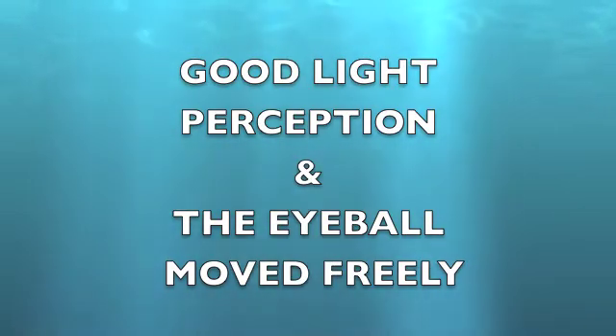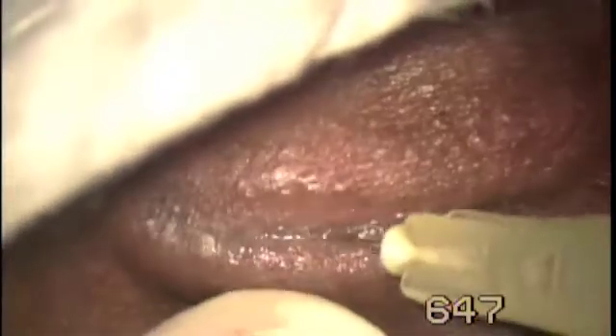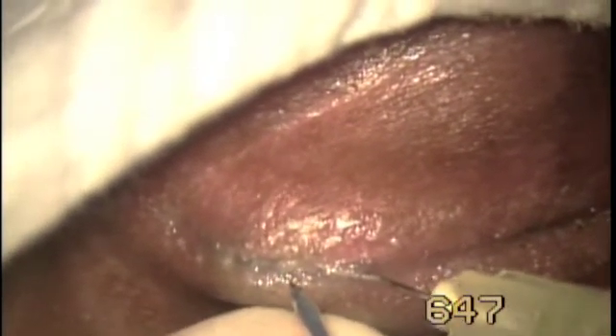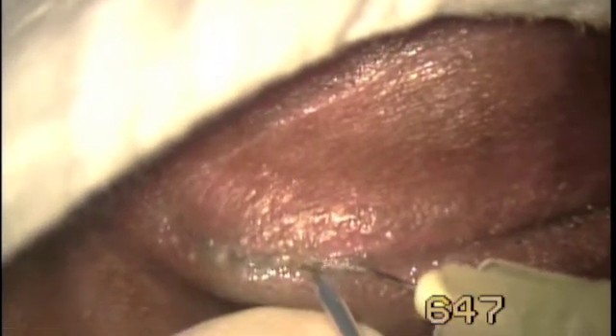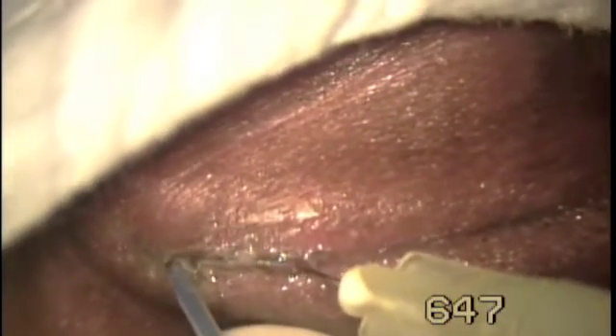We decided to release the adhesions with Fugoblade. The plasma energy of Fugoblade cuts without bleeding and without charring. A small hole was made at the fused lid margin and a 30-gauge cannula was introduced under the adhesion. The cannula was lifted and the cutting was done with Fugoblade.